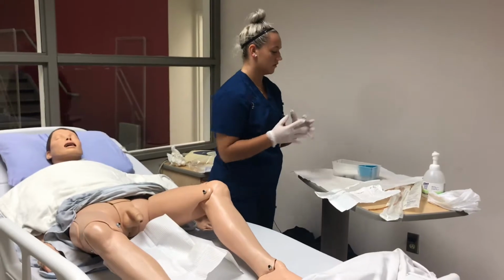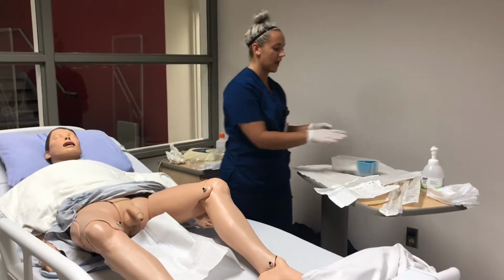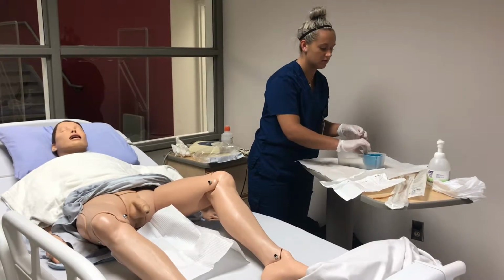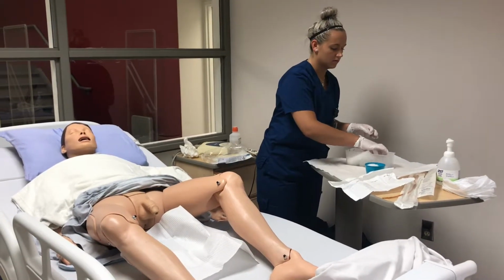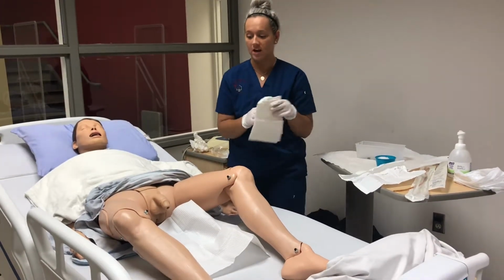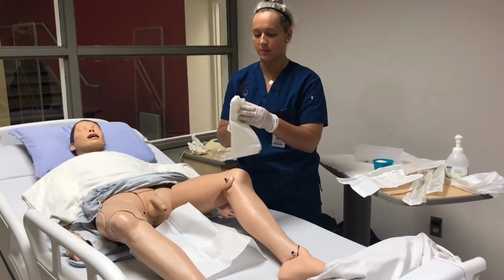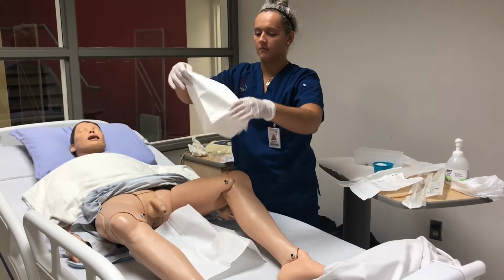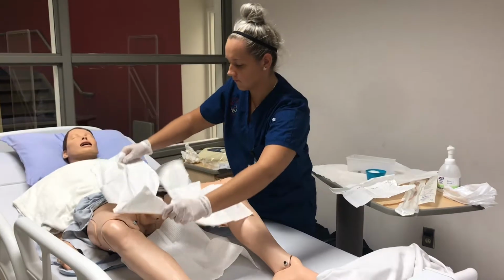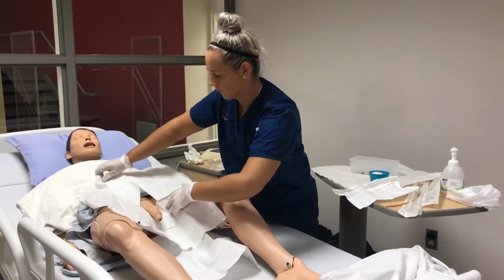So once your sterile gloves are on, you're able to touch anything in this field. So you're just going to want to take everything out. And then you're going to want to put the fenestrated drape over top of the patient's penis. Again with the shiny part.